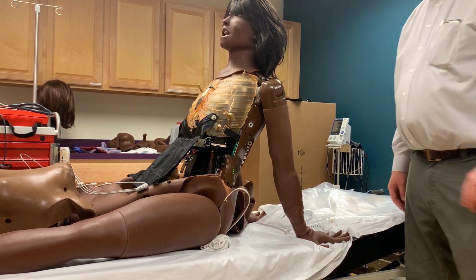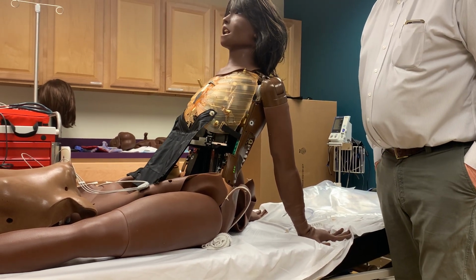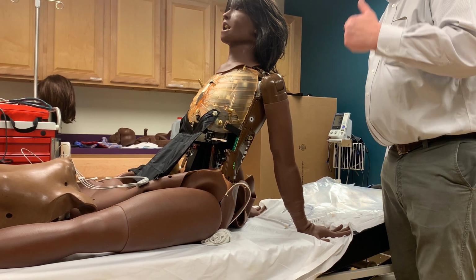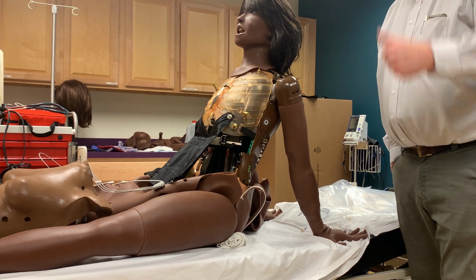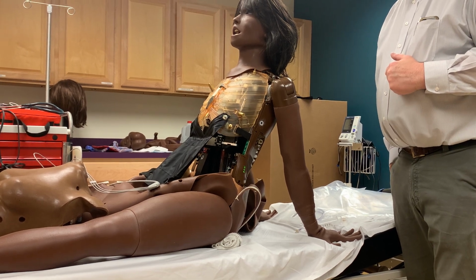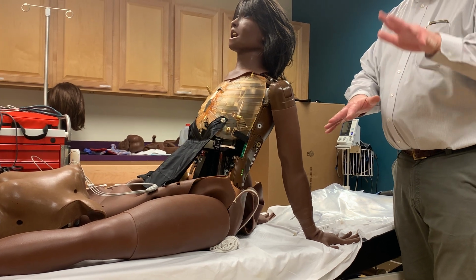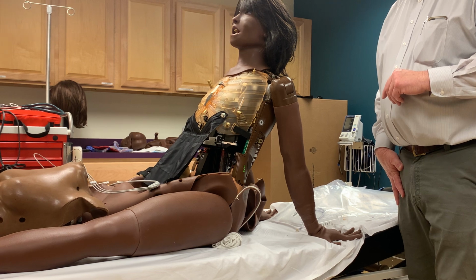over time, you're going to see a lack of motion on one side. Okay, which means also because there's no motion or no ventilation on that side, there will be no breath sounds. I don't need to go into the software and turn them off. It happens automatically because of this process. So what the students, if they were just palpating her chest, they would feel that one side is not moving, the other side is. On auscultation, will they hear anything different?